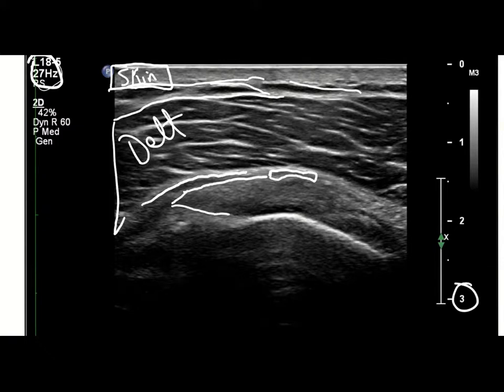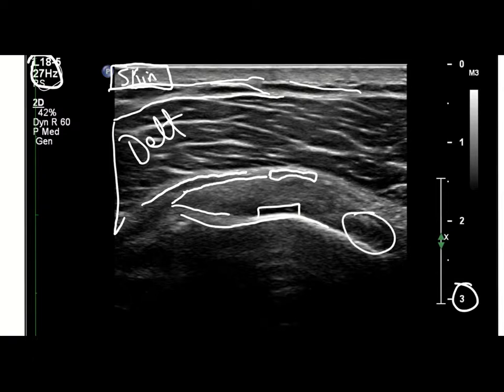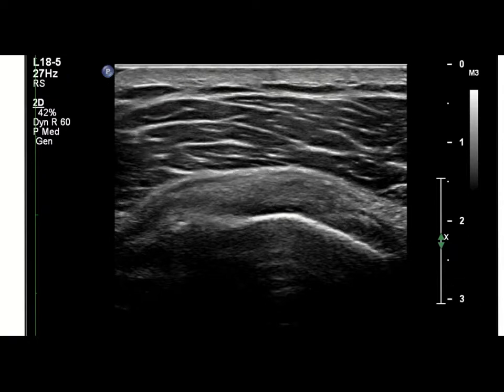The supraspinatus tendon is more oblique here, and then we have the bone here — this is actually some cartilage. And then this is oblique on the biceps tendon, which we'll see in a few minutes.